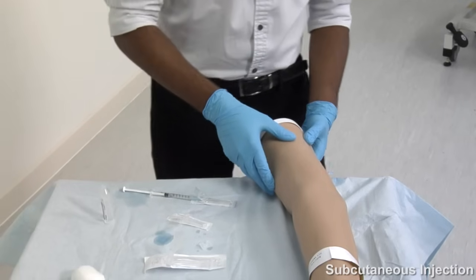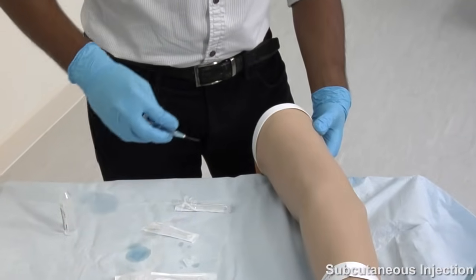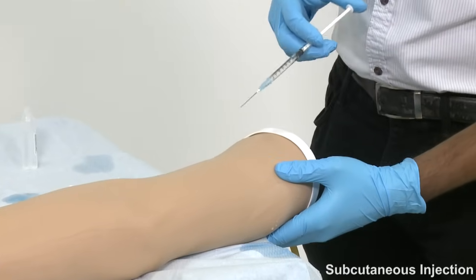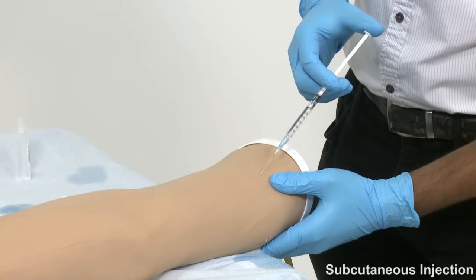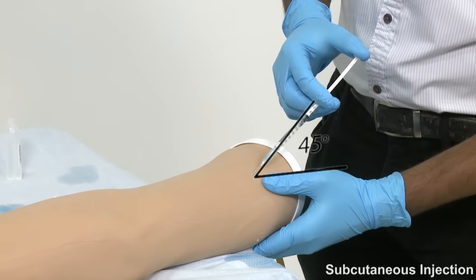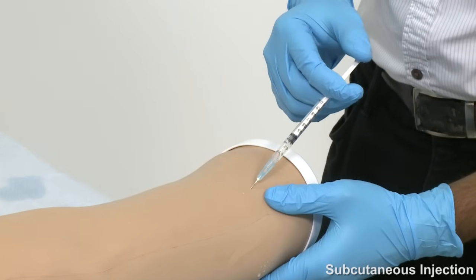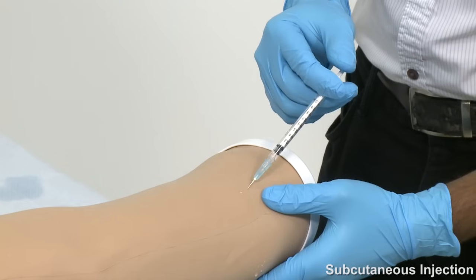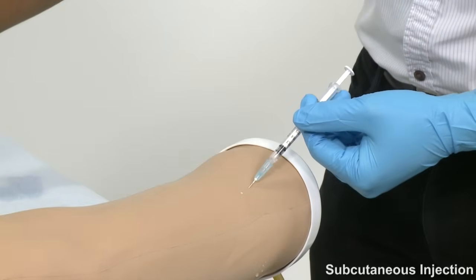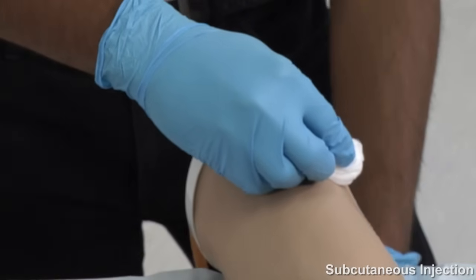Stabilise the skin with your non-dominant hand. Current best practice suggests that it is not necessary to cleanse the target skin area with an alcohol wipe, provided the patient is clean. With your dominant hand, insert the needle into the skin at 45 degrees. It is not necessary to aspirate with a subcutaneous injection. Once you have withdrawn, apply pressure with the cotton wool ball and dispose of the sharp immediately.